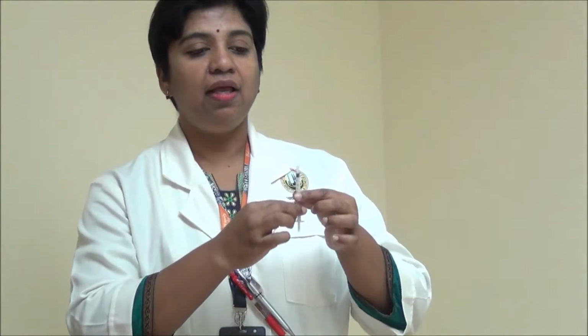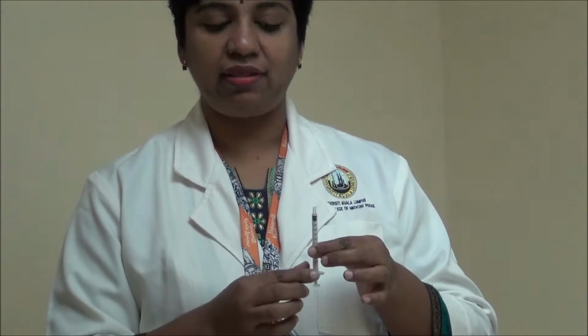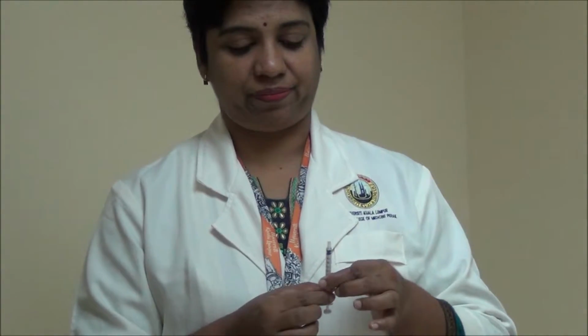Before that, let me tell you which part is clean, which part should be maintained sterile. The whole injection procedure is a clean procedure. However, you need to maintain sterility of certain parts of the syringes and needles and the medication in order to avoid contamination and prevent unnecessary infection.